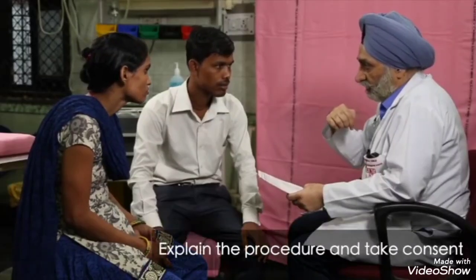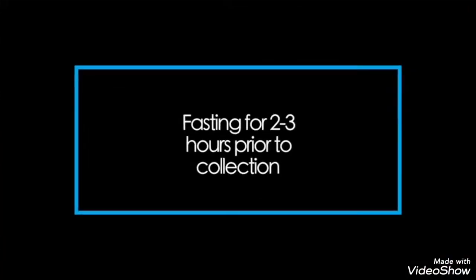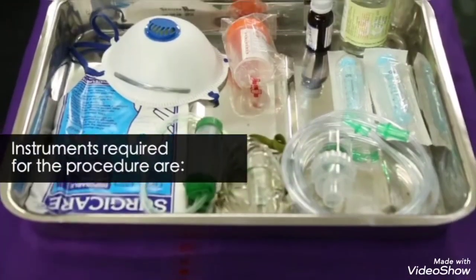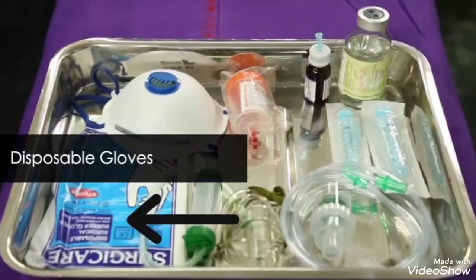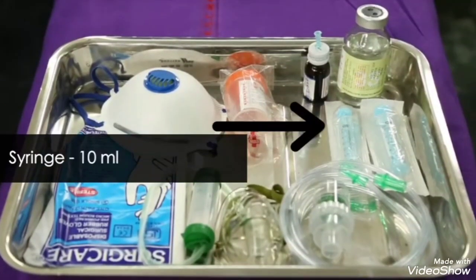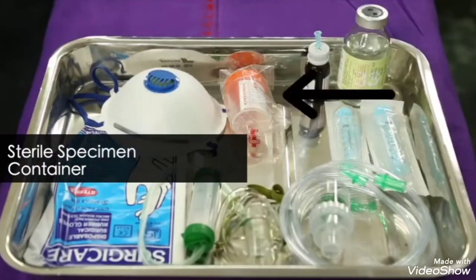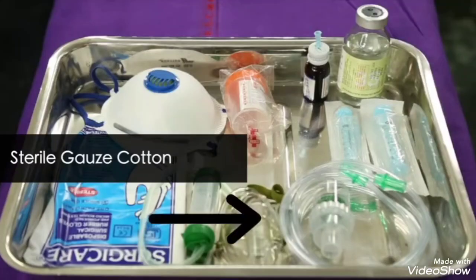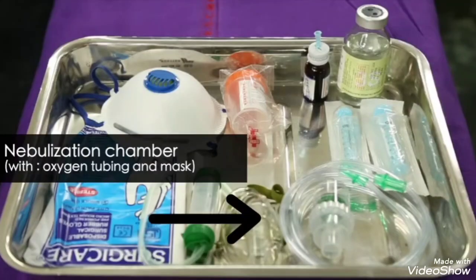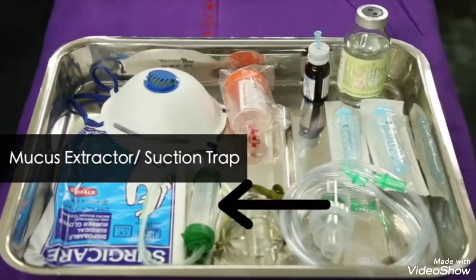Explain the procedure and take consent from the parent or guardian. The patient should be fasting for 2 to 3 hours prior to the collection procedure. Instruments required for the procedure are disposable gloves, hypertonic 3% saline, 10 ml syringe, needle, adhesive tape, sterile specimen container, sterile gauze cotton, nebulization chamber with oxygen tubing and mask, salbutamol, and mucus extractor or suction trap.